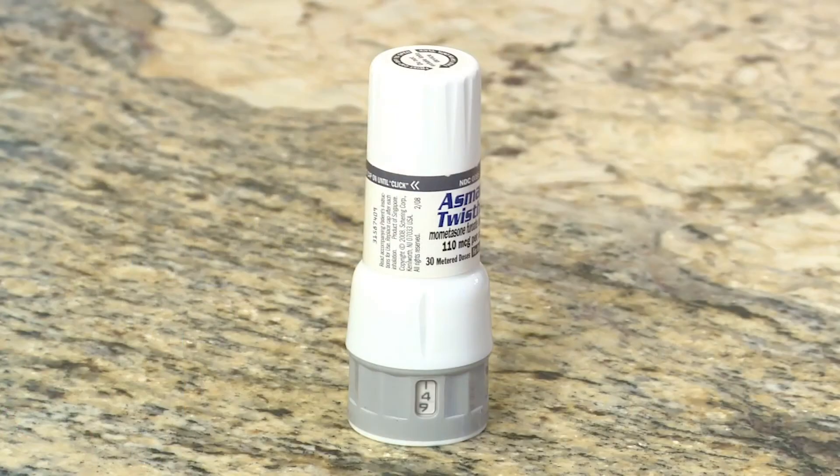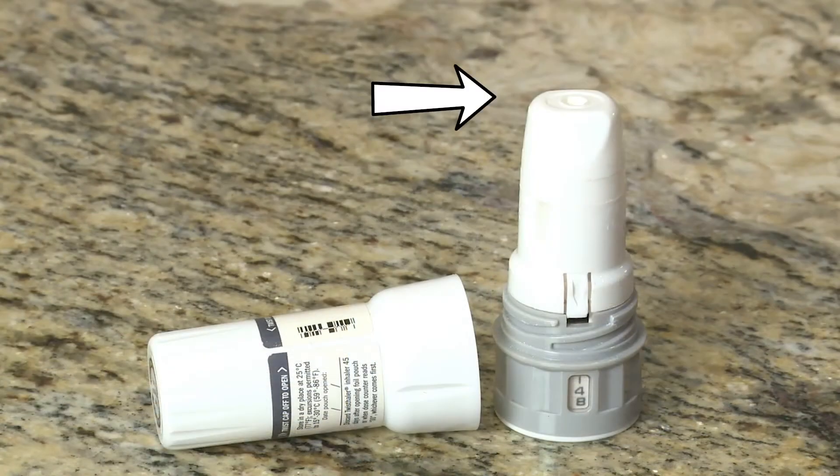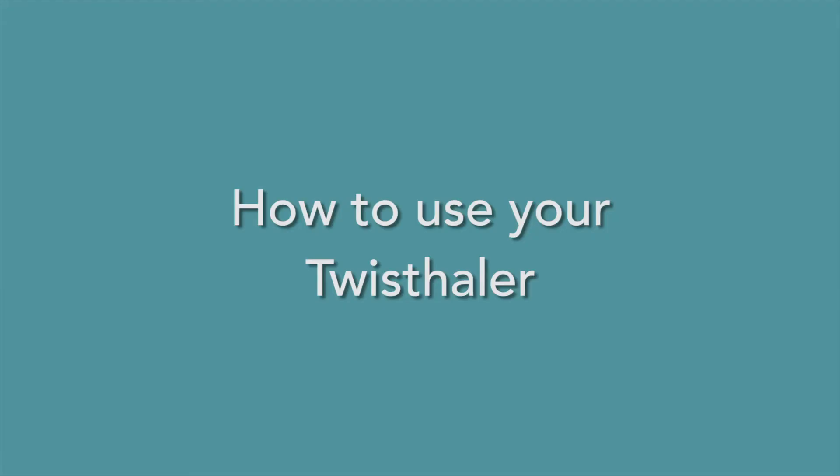This video will show you how to use your twist haler. The twist haler holds the dry powder medicine. When it is closed, the cap keeps the mouthpiece clean. The mouthpiece is where you breathe in the medicine. The counter keeps track of how much medicine you have left in the twist haler.